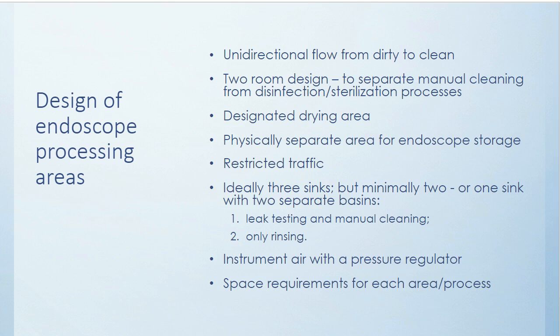We want to make sure we have unidirectional flow from dirty to clean for endoscopes. We do prefer a 2-room design. In the standard, we say that to separate those processes, it is preferred that you have 2 distinct separate areas. We know that's not possible today, but we want to move the industry to that because we do have data to support that change. In the meantime, if you can't have a 2-room design, you make sure you have that unidirectional flow, and that your infection preventionist can come in and really look at or audit what's going on in that facility.